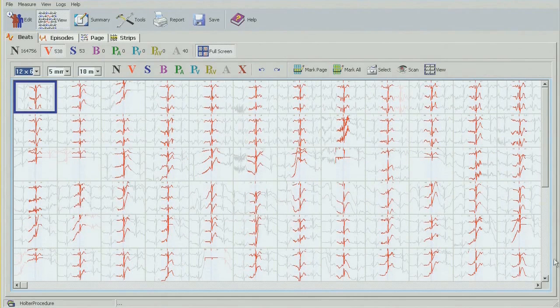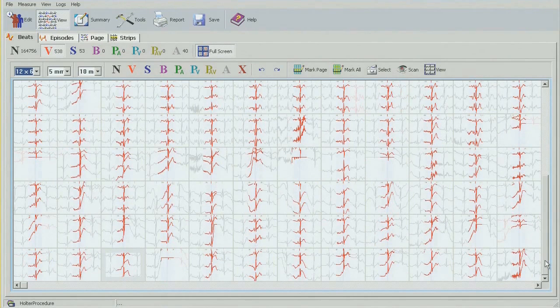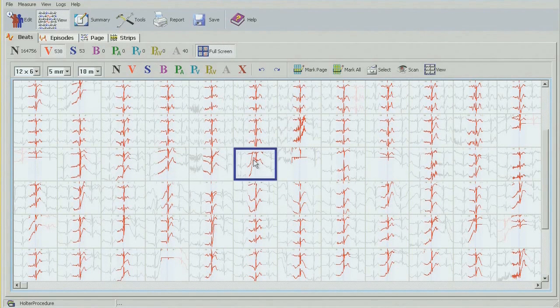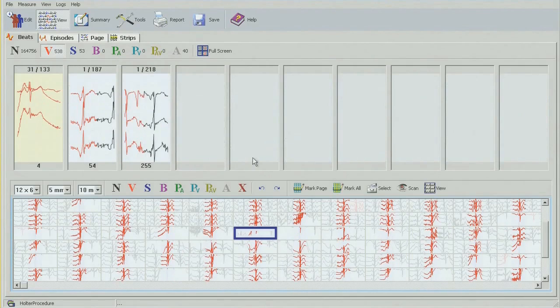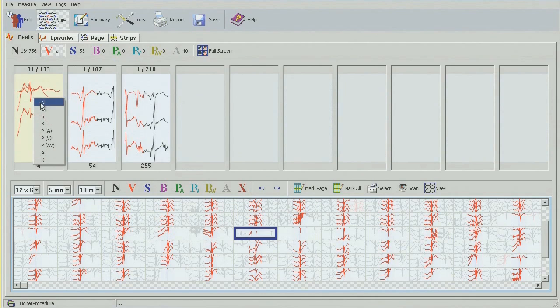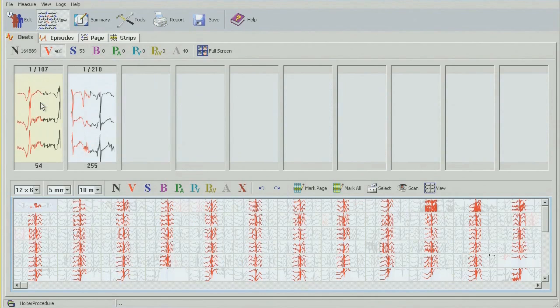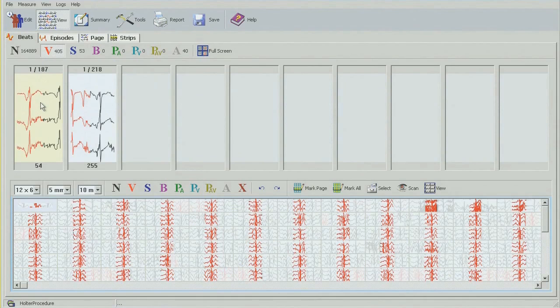Looking through all these beats, they all seem to be normal. To go out of that mode, click on any of the boxes and use the Z button. I'm going to change the whole bin into normal beats by right-clicking, and this changes all the beats to normal.